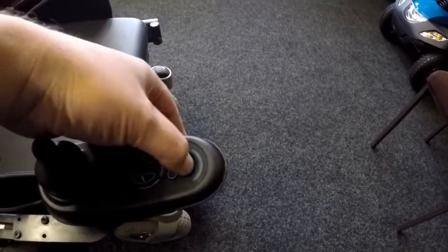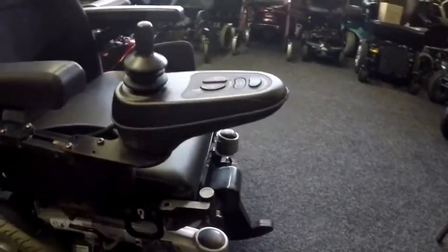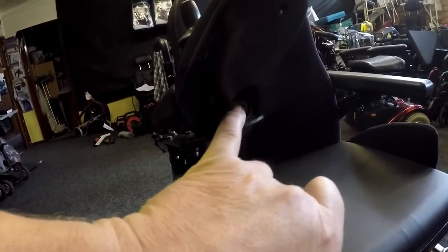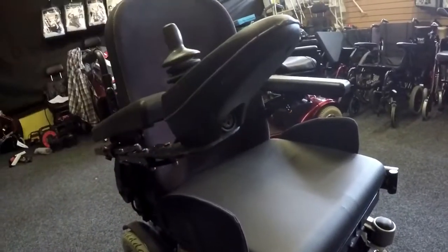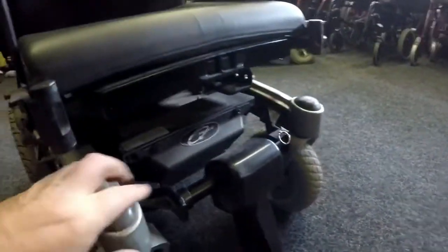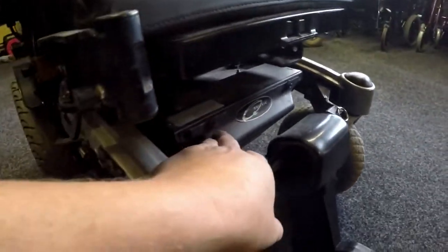Now, it's not coming on at all, so the first thing I'm going to do is test with the voltmeter. I'll stick my voltmeter in the front here, the two outside connections, and check to see if we're actually getting voltage here. If we are getting voltage, I'll follow the cable, going round here and down the side, to the control box, well, the power module, and this particular one is under the front panel here.